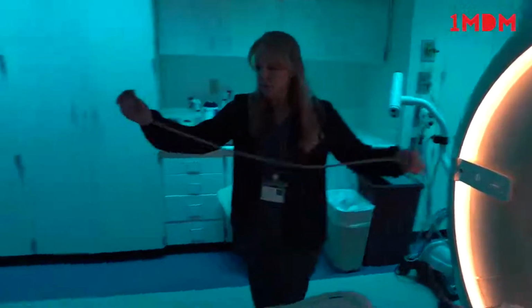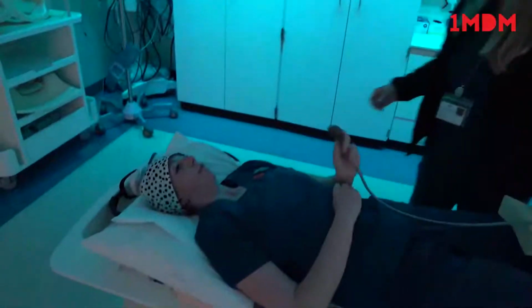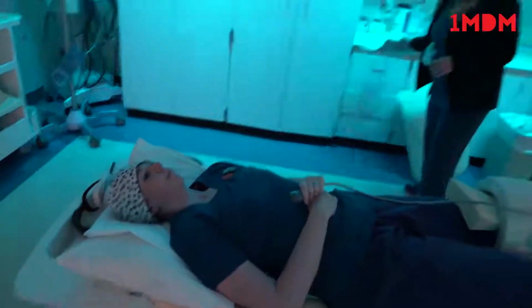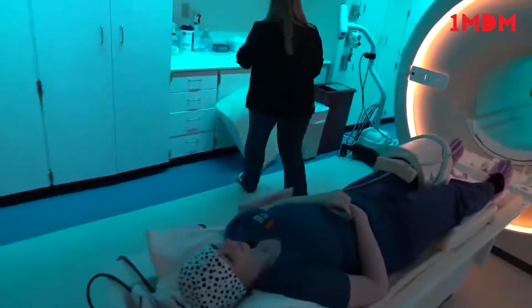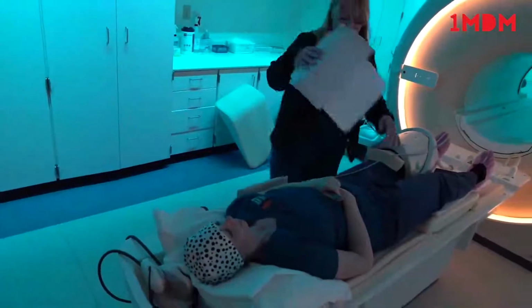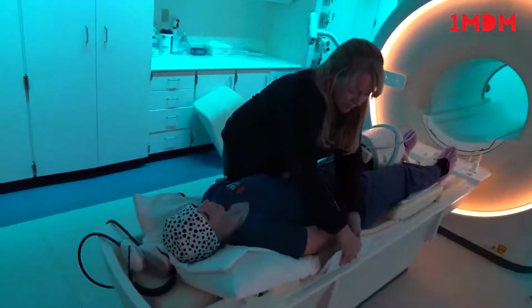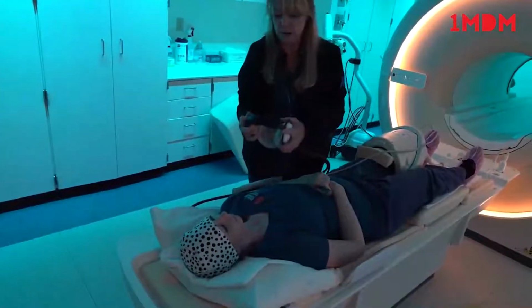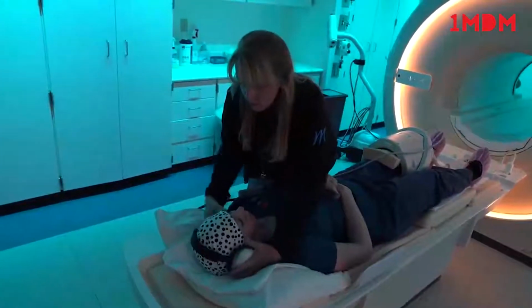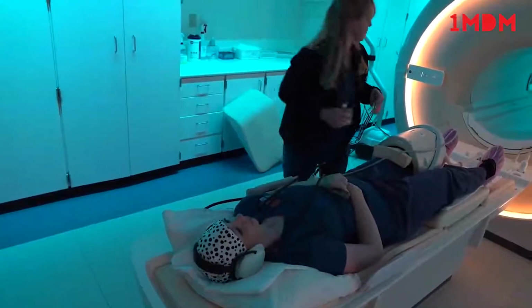Panic button if you do need me. Squeezing twice on that lets me know something's not right. I need to come in and take care of you. Some side supports for your arms. And then we're going to put the headsets on to help with the noise and give you a little bit of music, okay? About 20 minutes, holding that knee really still.